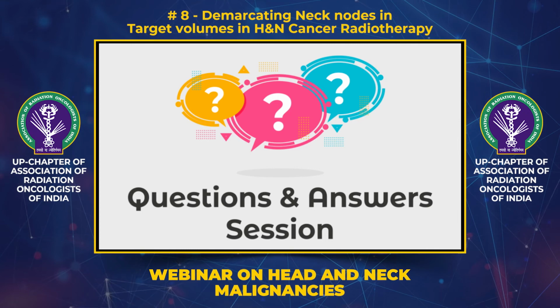Ideally, it is not recommended. Current evidence is in favor of contouring the retrostyloid group of lymph nodes only if the level 2 is bulky, and or if the disease is extending up to the nasopharyngeal region. Like if we have a tonsillar lesion and it is extending into the nasopharyngeal region, then the retropharyngeal and retrostyloid group of lymph nodes have to be taken into account, even if the neck node at level 2 is subcentimetric. Otherwise it is not recommended. Only if level 2 is grossly involved, more than 1 centimeter in size, then we have to take into account the retrostyloid group of lymph nodes.